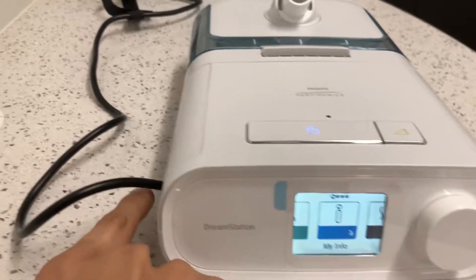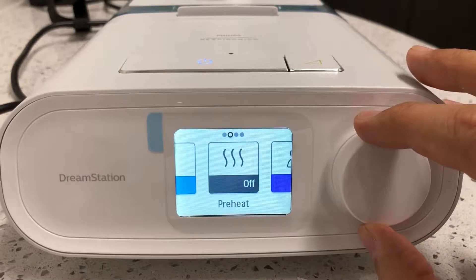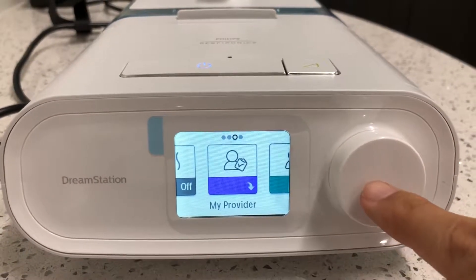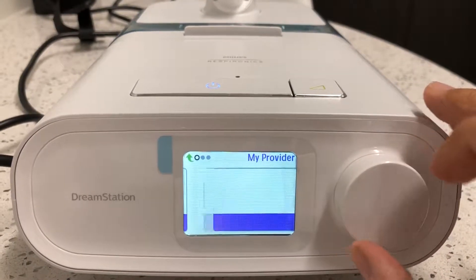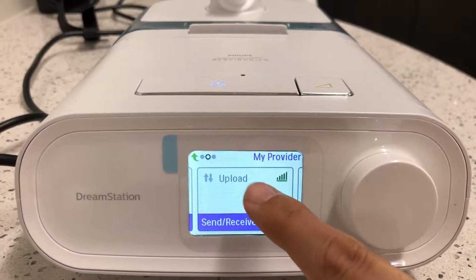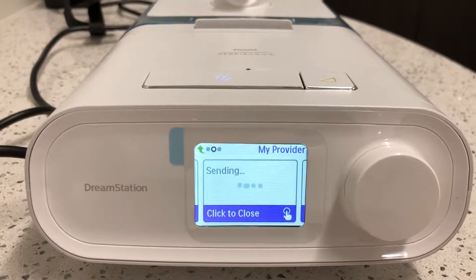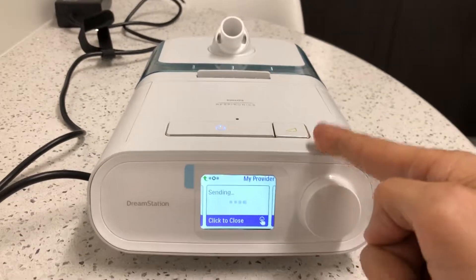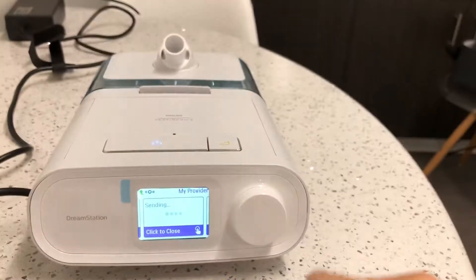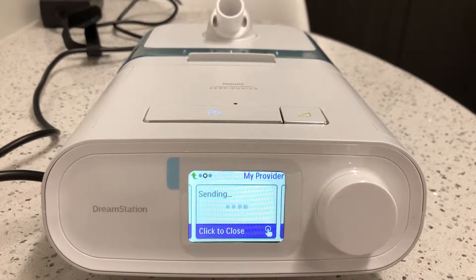So basically when you plug in the machine you'll get this screen. What you're going to want to do is go two clicks over to 'My Provider,' press this button here, go one over, and you're going to see 'Upload Send Receive.' When you click this, it's going to start sending — it's going to sync the signal from here back to our computer, and we'll update this with any changes that we've made that day.